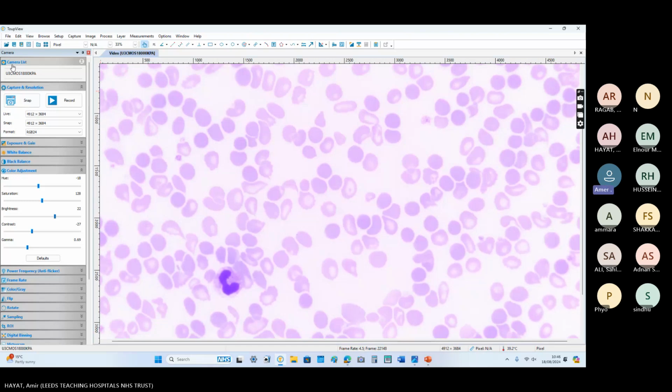He has been transfused, but we need a diagnosis for this patient to bring her under our NHS services if she has any hemoglobinopathy. I would like to ask for a hemolysis screen along with HPLC and both parents' CBCs and their HPLCs.